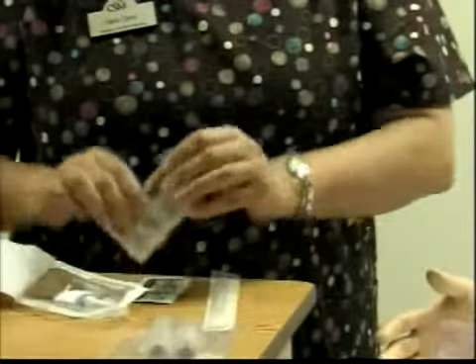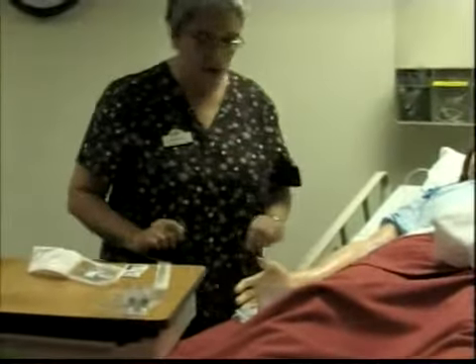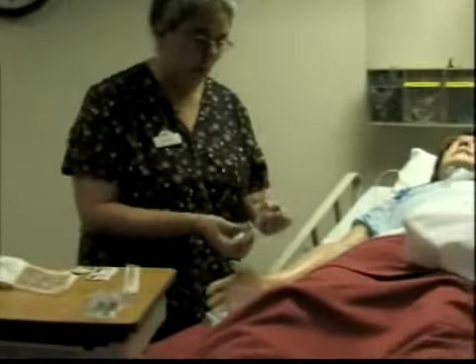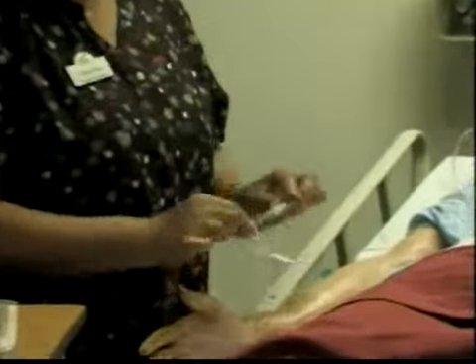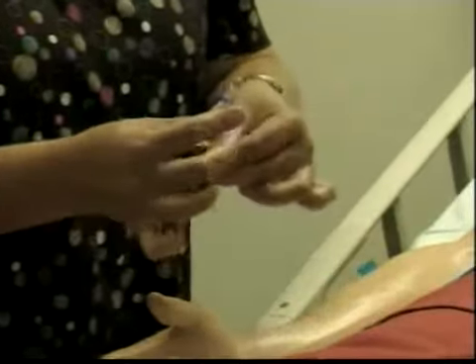You have your extension. Now, this is something that you'll see a lot. Nurses will open an alcohol swab and put it close to the patient's site that you're going to puncture, so you can rest your extension and have it easily accessible. You will only have one hand when you're going to incorporate your extension into your hub, so you want to make sure that you have it available and easy to access.